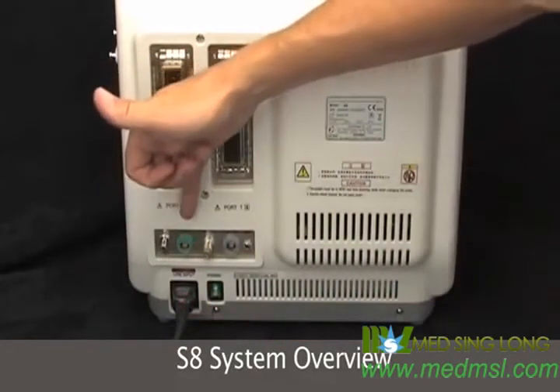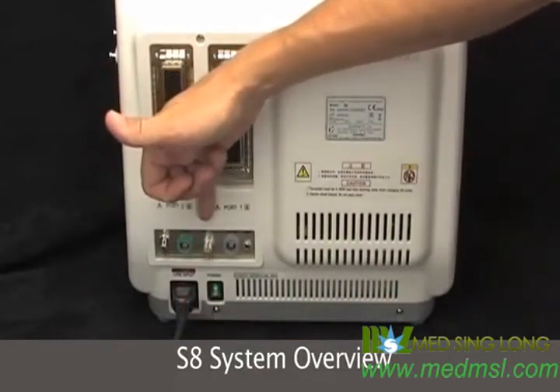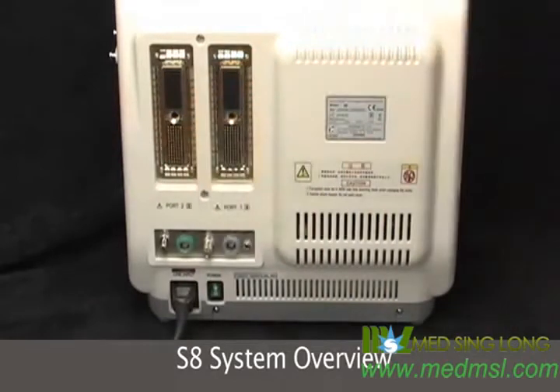We have a ground, ECG leads, video in and out, foot switch, and a printer port.